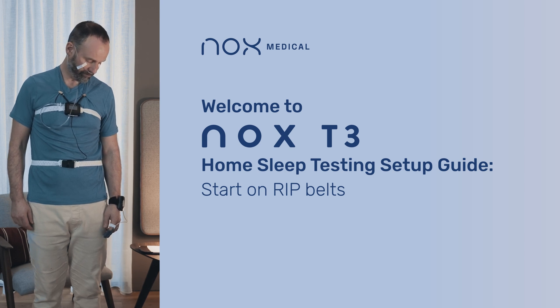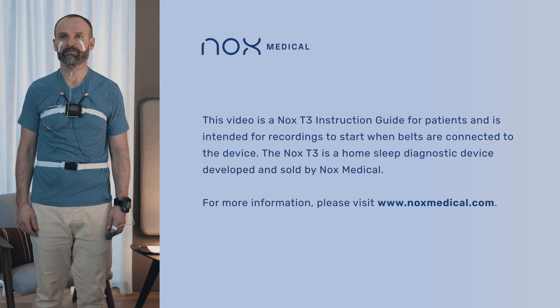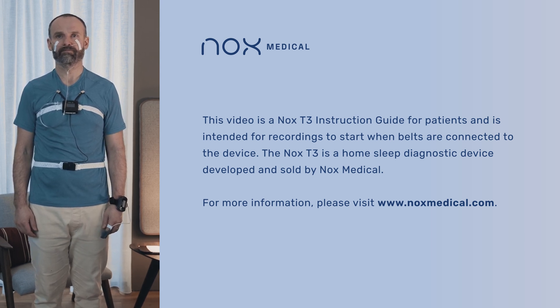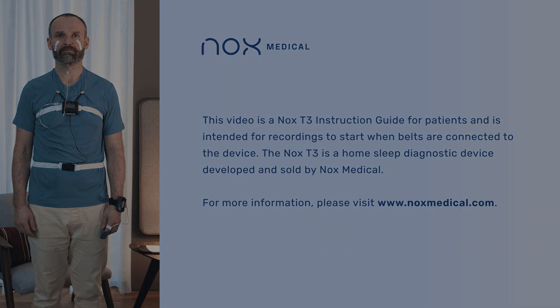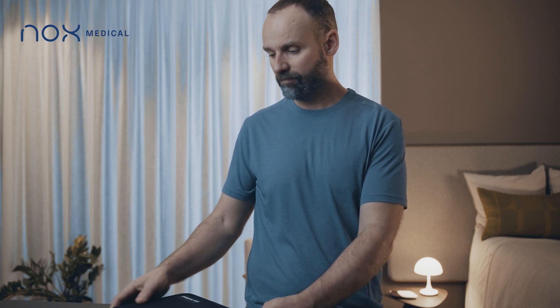This video is intended as a guide on how to set up the Knox T3 sleep system. The carry case includes everything that you need for the home sleep study.